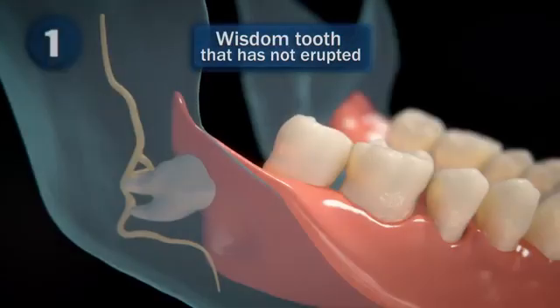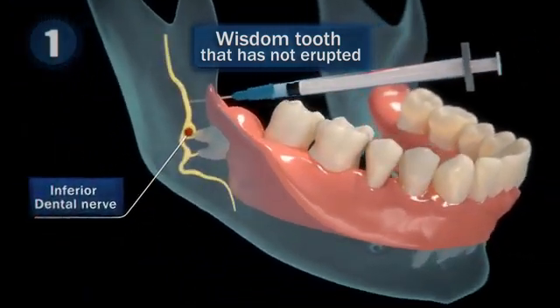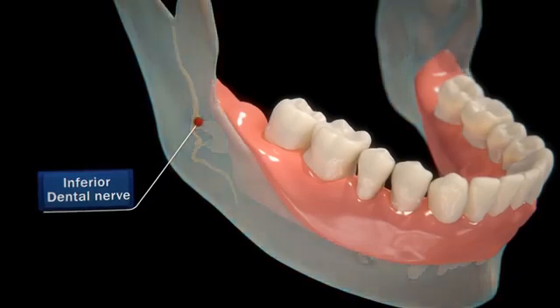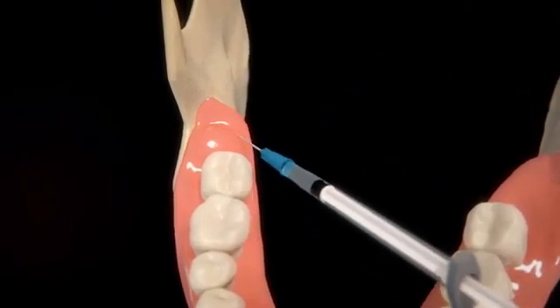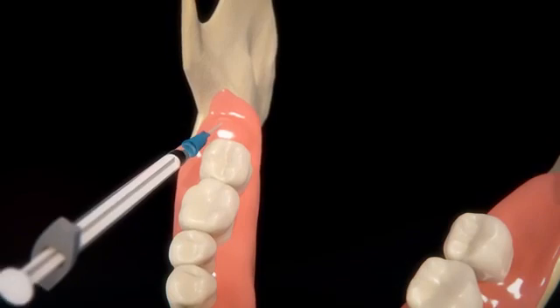To extract a wisdom tooth that is not erupted, the dentist will perform a nerve block technique to the inferior dental nerve in the area where the anesthetic will be applied. After 1 minute, when it has taken effect, the expert will proceed to anesthetize around the tooth with the help of an injection.